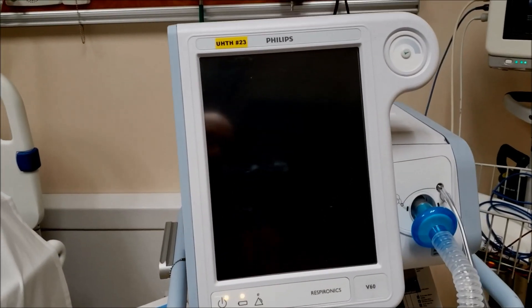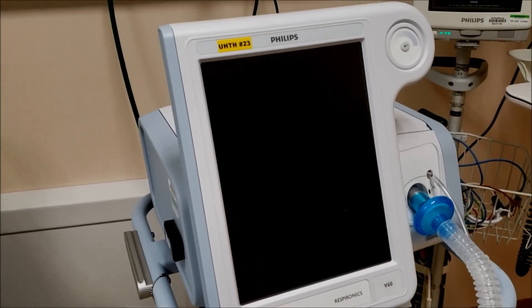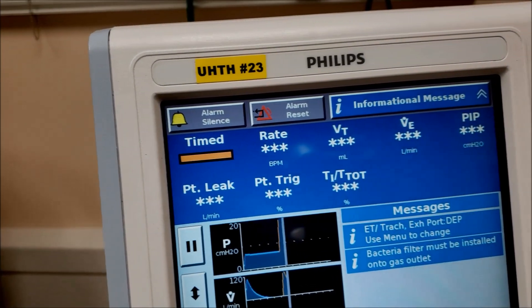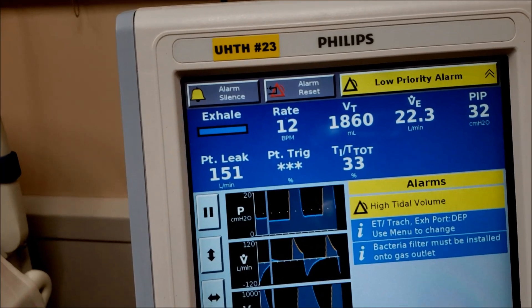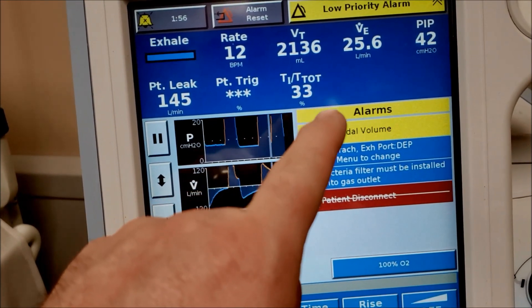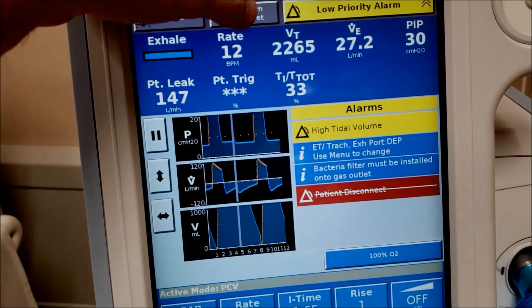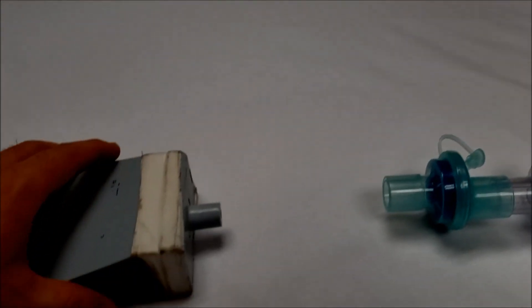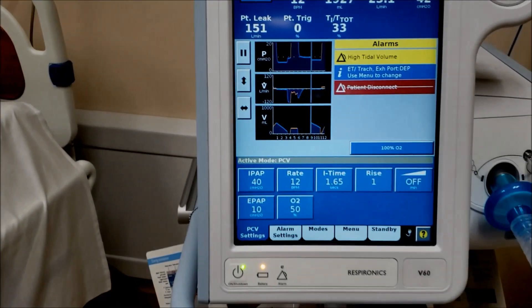Let's turn this on and get started for mechanical ventilation. Hit start at the bottom. When it comes up you'll see alarm silence, alarm reset, and informational messages — this comes up every time. Let's silence it so we can think. You'll see yellow alarms: ET trach setup, bacterial filters installed — those are nice informational alarms. Hit alarm reset to clear those. Then connect the test lung to make it quieter.